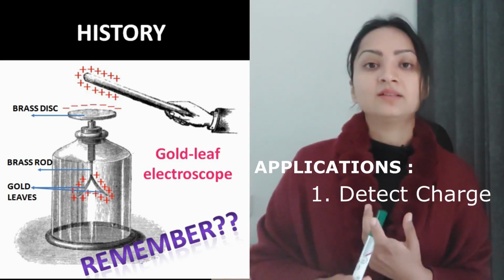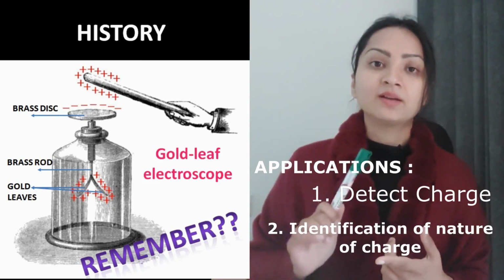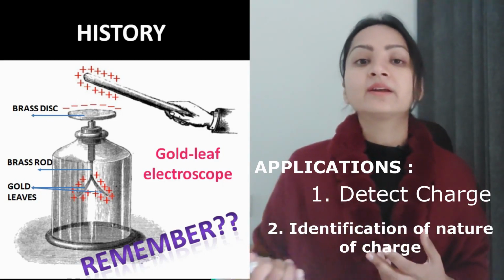So this can detect the presence of charge. Another thing that it can do is that it can also tell us about the polarity, whether the charged body is positively or negatively charged.